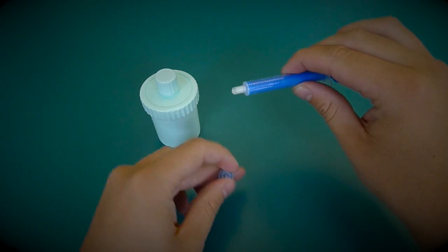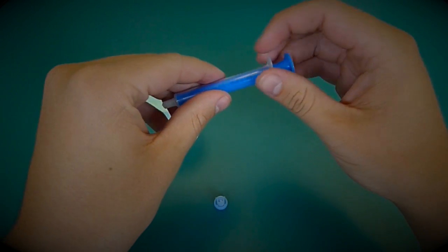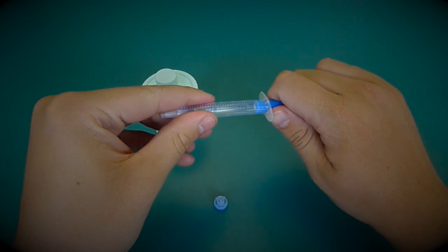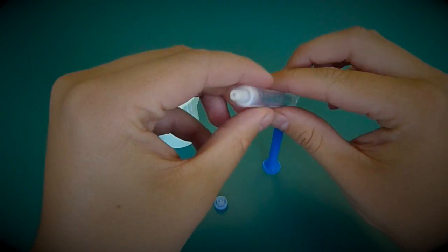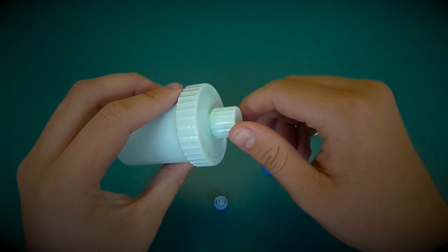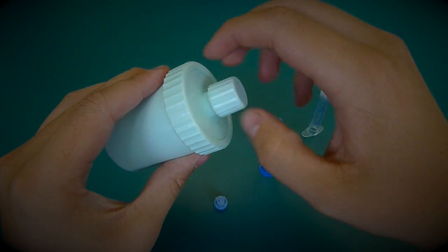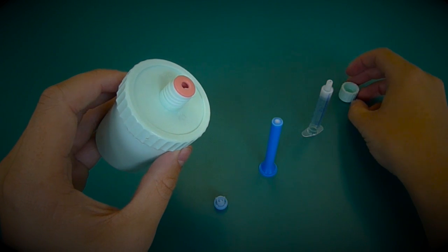Start by removing the tip cap then the plunger from the syringe body and set them aside. You will then take the EMP jar and remove the small cap from the top to reveal the adapter for the oral syringe.